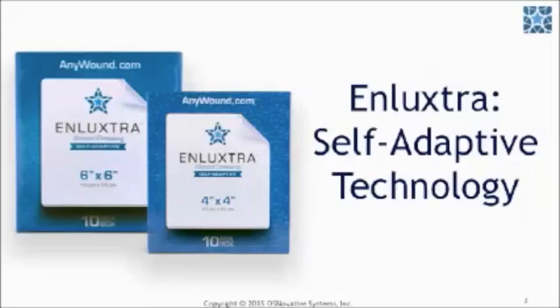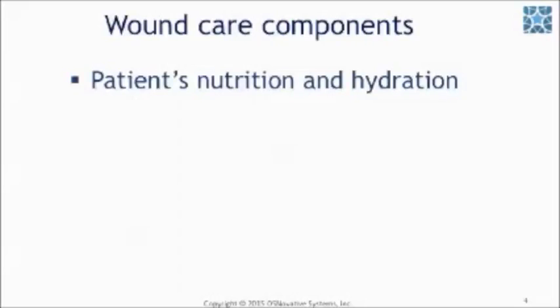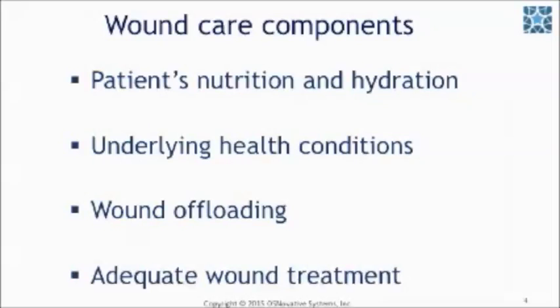Let's begin. Every wound care professional knows that the wound healing process involves several equally important components: the patient's proper nutrition and hydration, assessing underlying health conditions, wound offloading, and adequate wound treatment. Now, let's discuss wound treatment challenges.